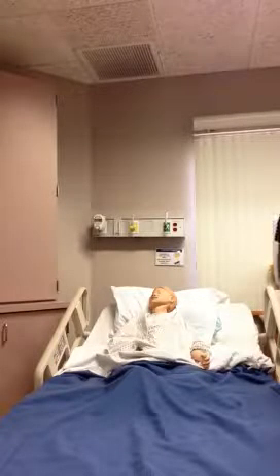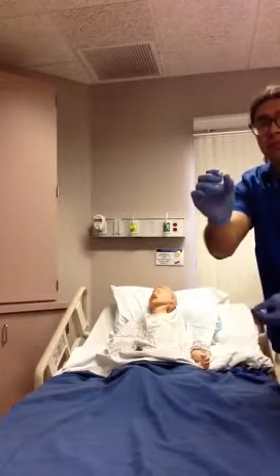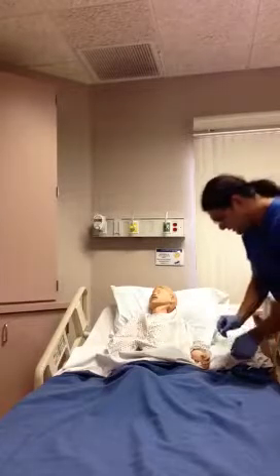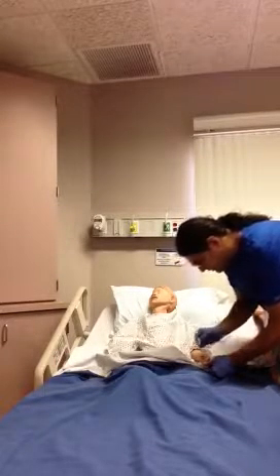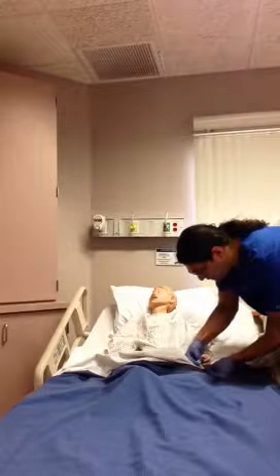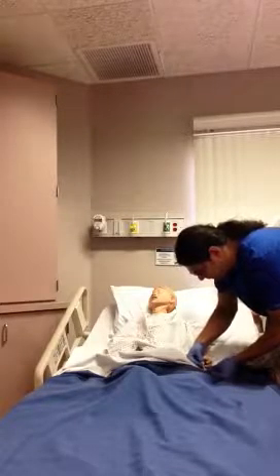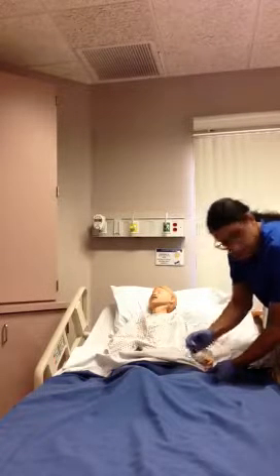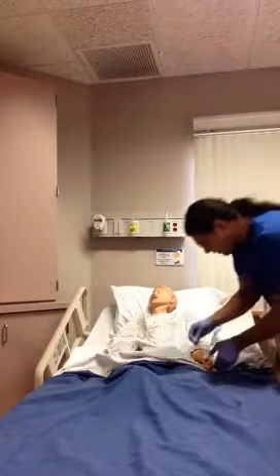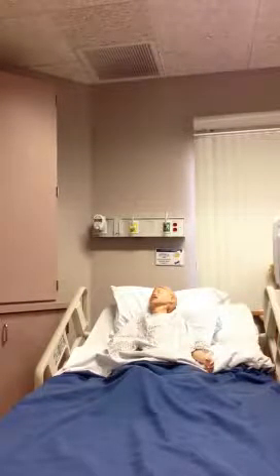So now we get the lens set. I removed the protective cover, and now I have to trigger the lancet. I did it on the ring finger, the one that I had wiped clean, so I'll go on the side of the finger here and depress the lancet into the finger. Okay. I will go ahead and grab a cotton swab or gauze, in this case cotton swab, and wipe the initial blood off. I will get the glucometer.